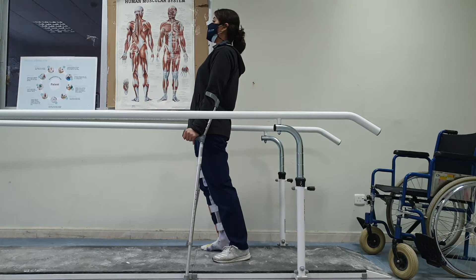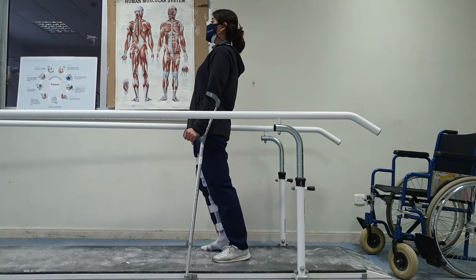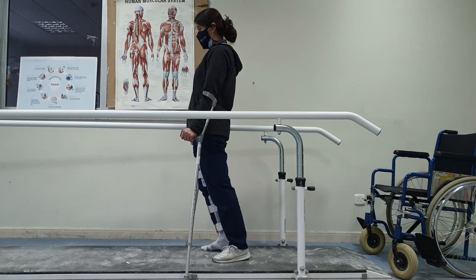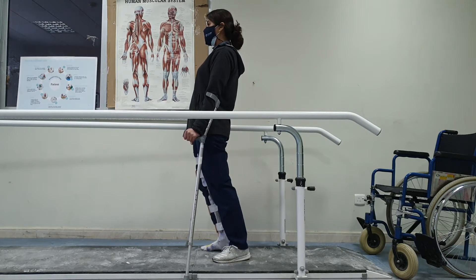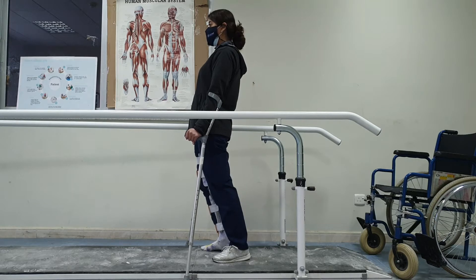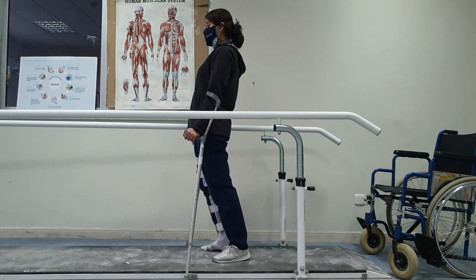In the next step we will repeat all the training we just did between the parallel bars while using the crutches. The patient is now standing while leaning on both crutches. As an important reminder, the therapist needs to be next to the patient in all of these exercises — we don't just leave the patient alone between the parallel bars.